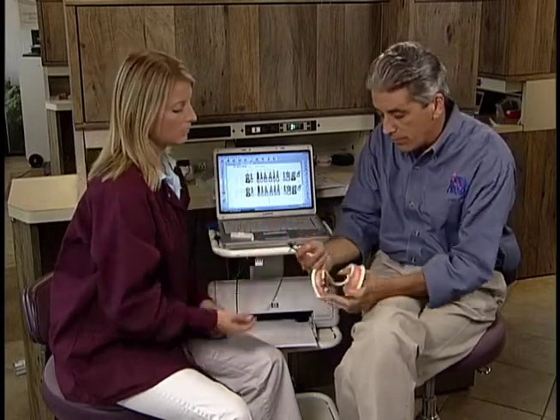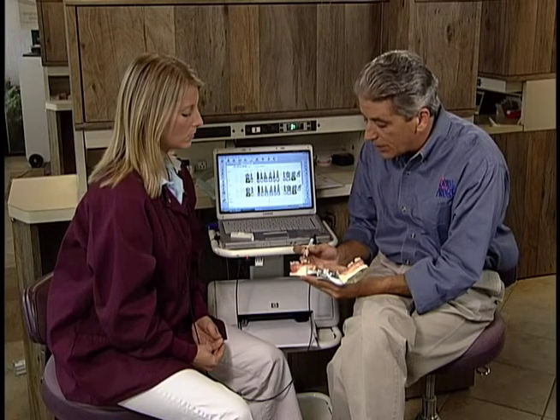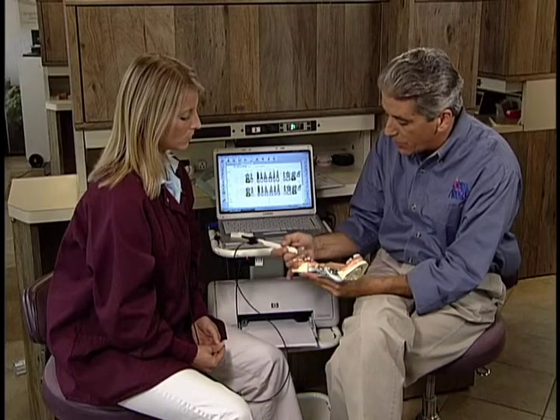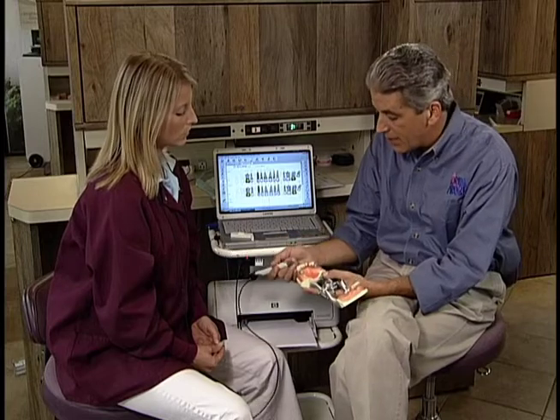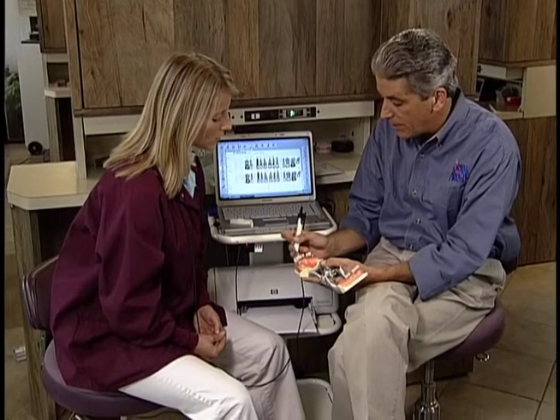This is an oversimplification, but I can't contact this margin because that occlusal surface stopped me. I need to be in contact with the free gingival margin, so I need to change the way I approach. Same thing can happen on some of these long anteriors. So I want to change the way I get there.